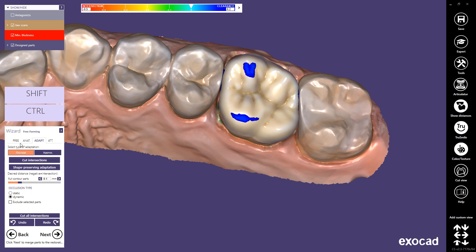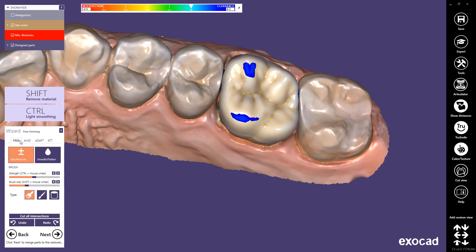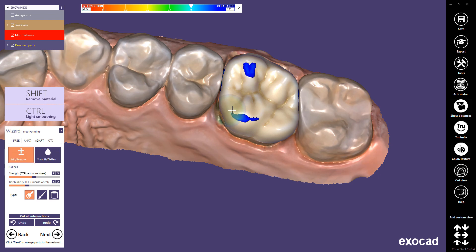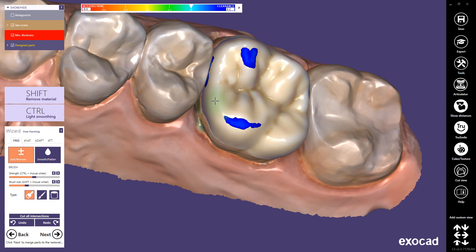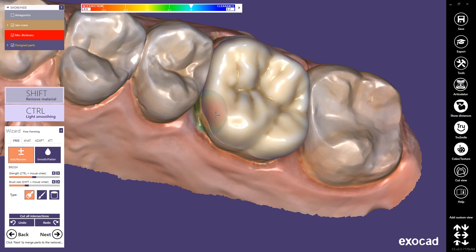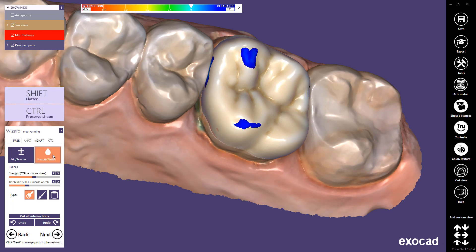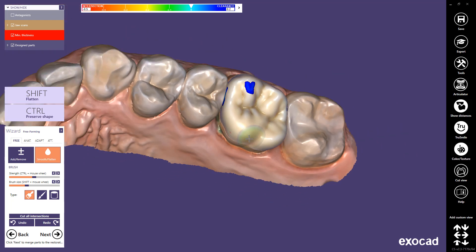Free adds, removes, or smooths material with a virtual wax knife. To add material, hold the left mouse button on the area of the tooth model you wish to correct. To remove material, additionally hold Shift. To smooth and flatten rough areas, hold the left mouse button on tooth areas you want to smooth.